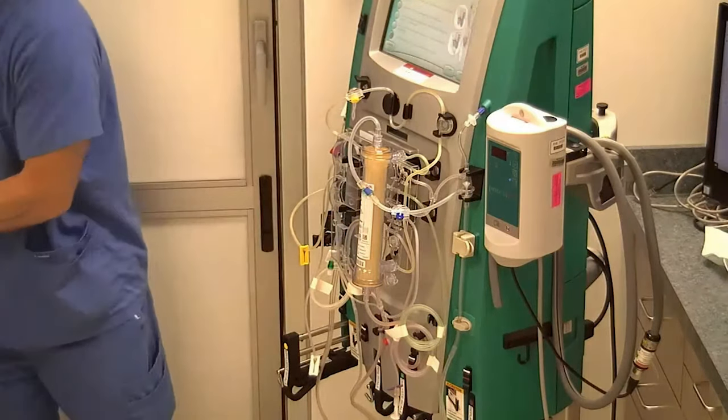And this is when the machine will load this tubing set onto itself. You also want to make sure as it's loading into the machine that any of the extra tubing is not going to get pulled in behind into one of the pumps.